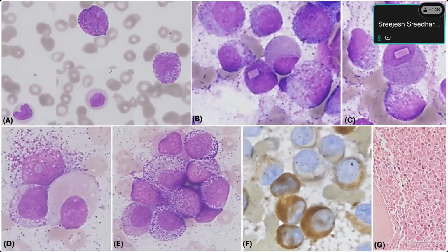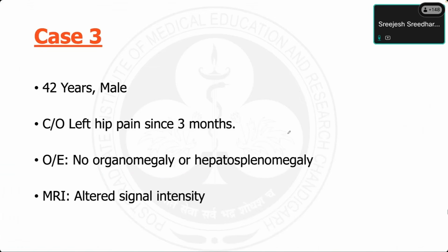So this is again another case of acute promyelocytic leukemia. You see that these cells are not classical bilobed abnormal promyelocytes, right? These have more of an eccentrically placed nucleus, but the cytoplasm is very hypergranular. These are some of our cases. So again, I want to highlight that promyelocytic leukemia can have a varied morphology. We have to keep a high degree of suspicion so that these patients are not missed and they should be started on therapy as soon as possible.